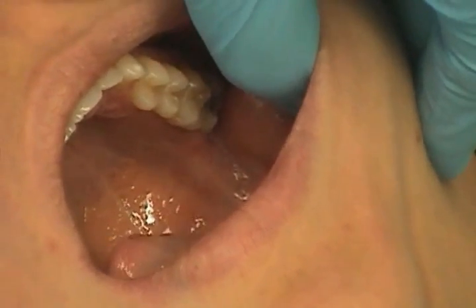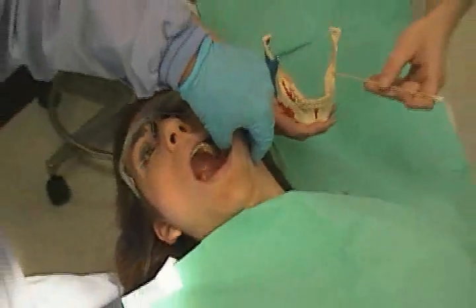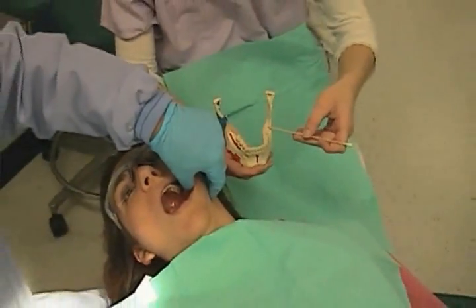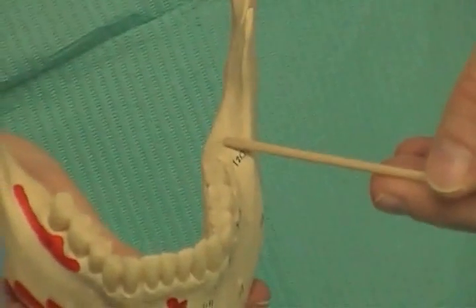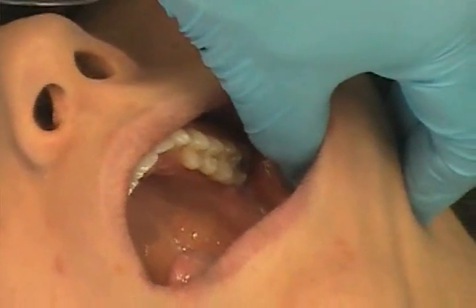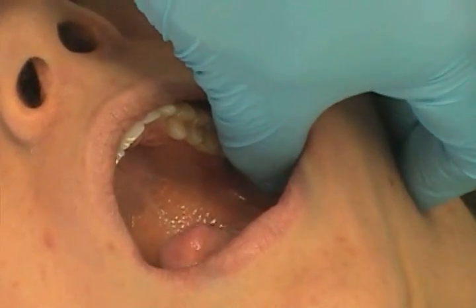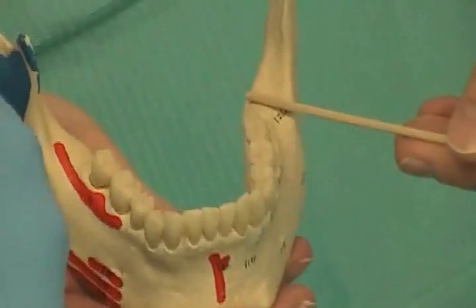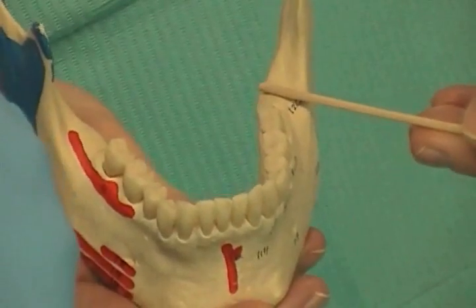To begin, we need to start by having our finger in the coronoid notch, which is the deepest depression on the anterior border of the ramus. You literally have to have your thumb on the anterior border. Start from the anterior border and move the thumb until you encounter the raphe, which should be on the tip of your thumb and oftentimes can be seen in the mouth.